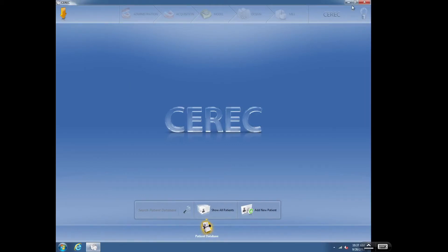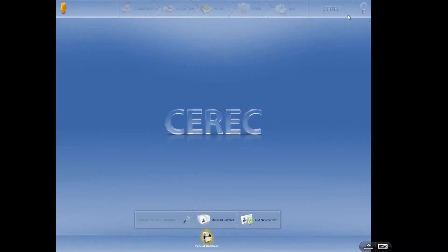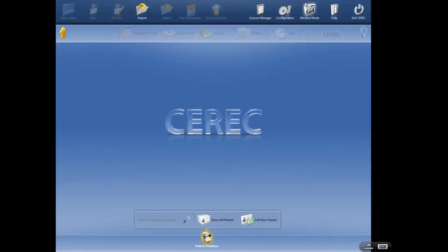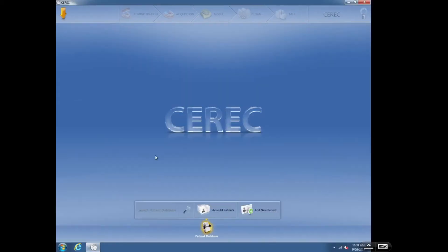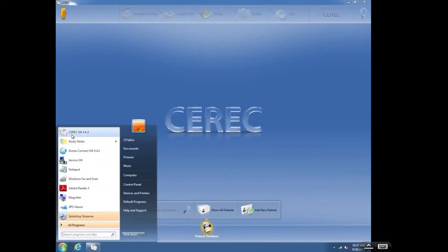To do that, you want to maximize like that. But to get out of there, we're going to select this window mode, which will minimize. And then at that point, if I want to add another CEREC screen, I go to the start menu and click this again, and then we'll get another window of CEREC open. At that point, I can start another case.